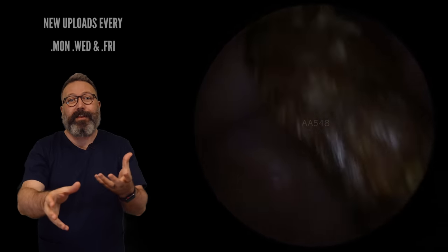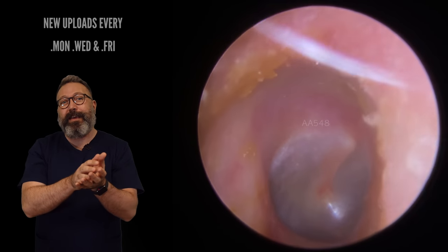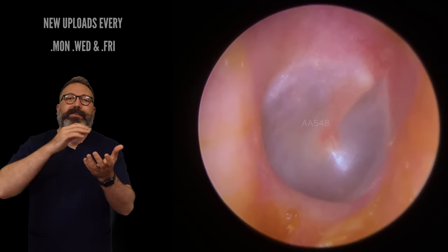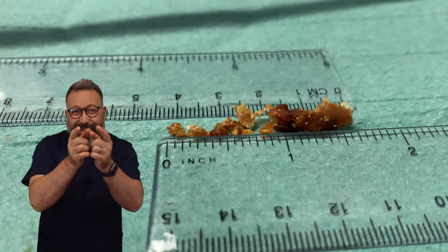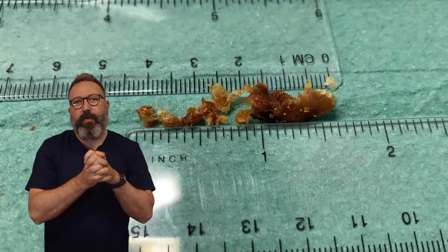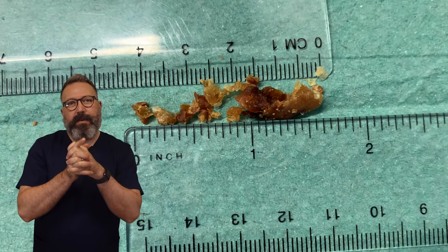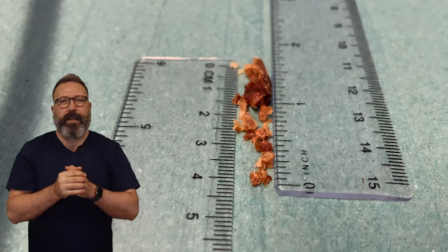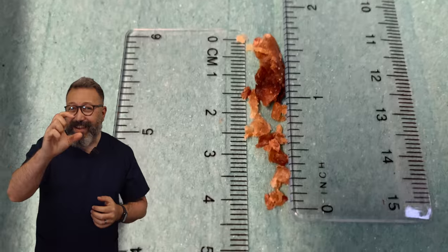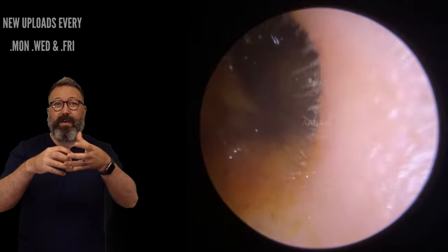It had pretty much gone the whole length of the canal. Wow, it took everything with it — that's amazing. You can see how we scooped that bottom section out, and it's taken away enough of that top section too. Look at the size of that plug — it's the right-hand side for you guys, it's reversed. So we've got four centimetres — about one and five-eighths of an inch. You can see a fair-sized piece of wax there. And don't forget, everything below that came away from the top section of the wax.